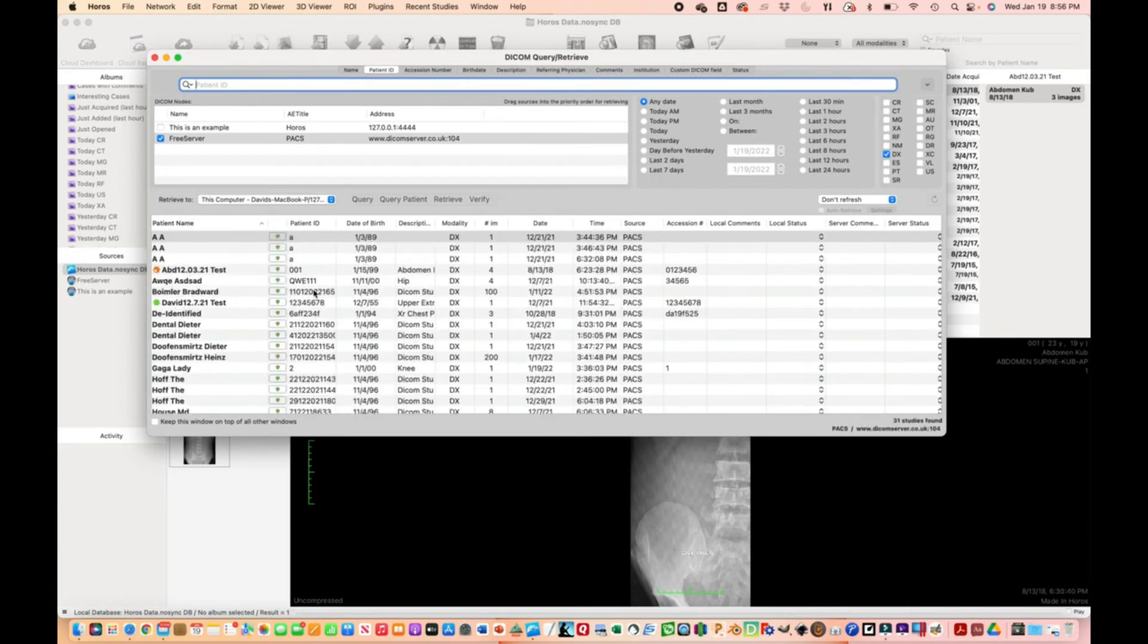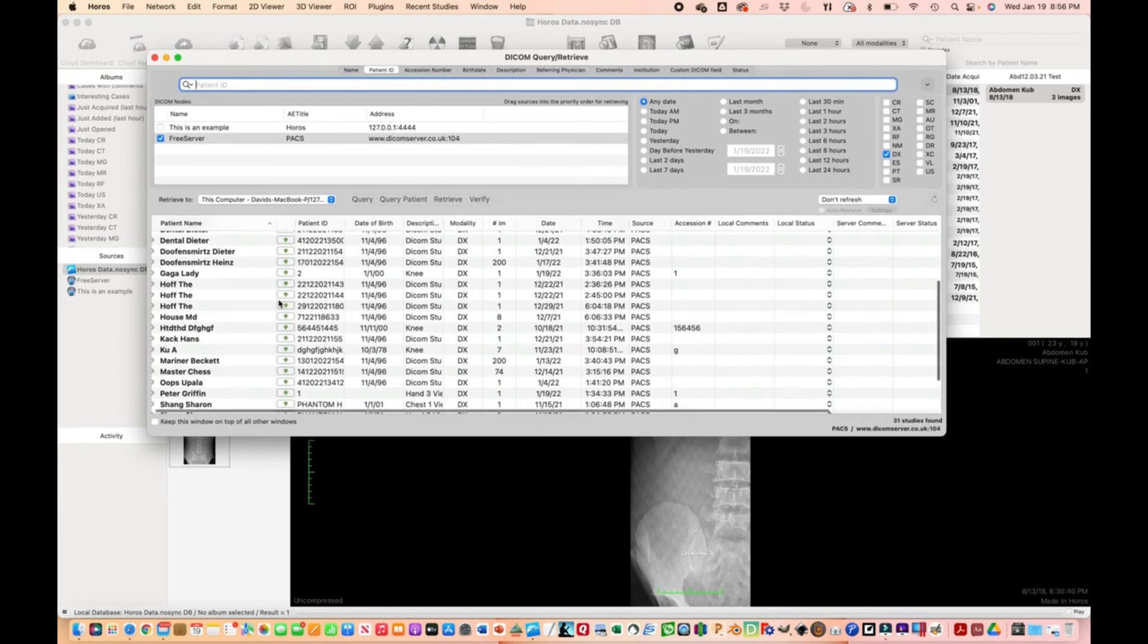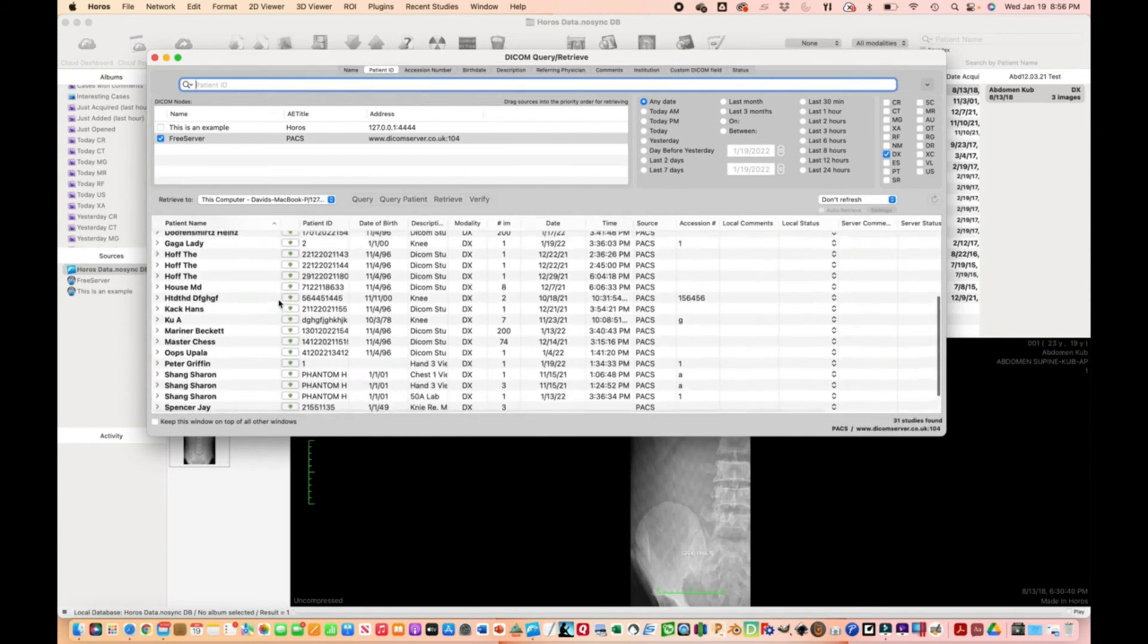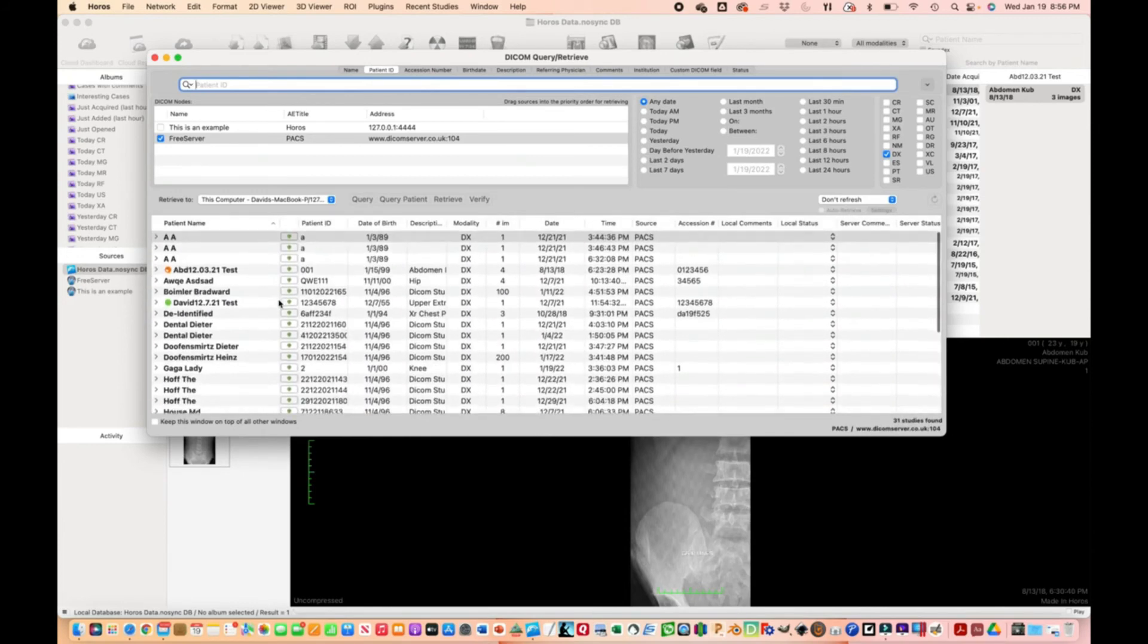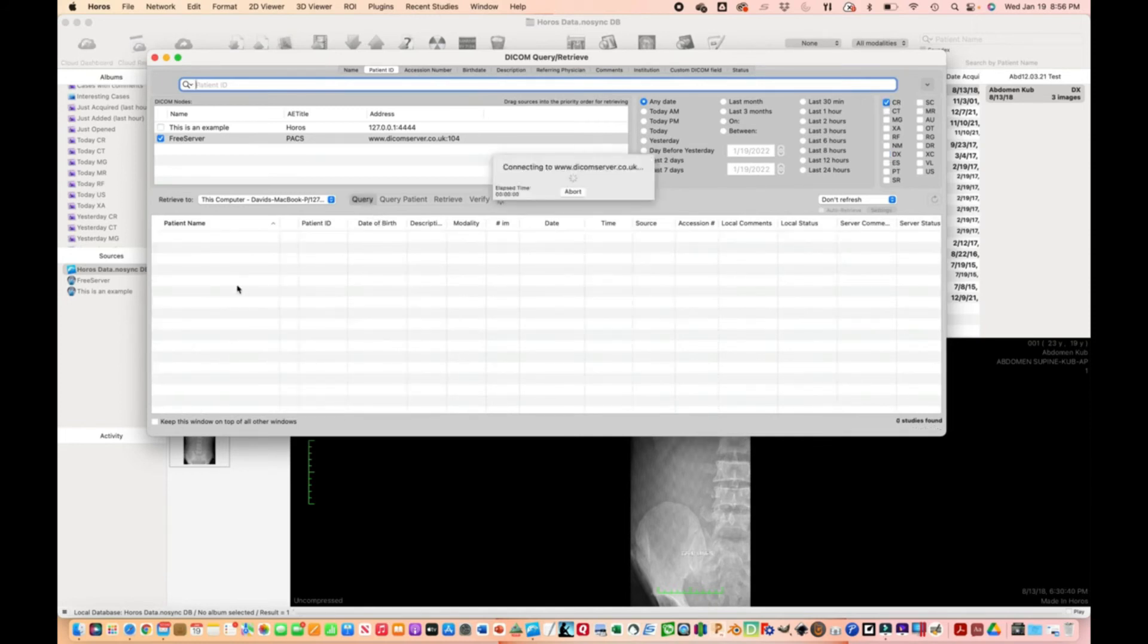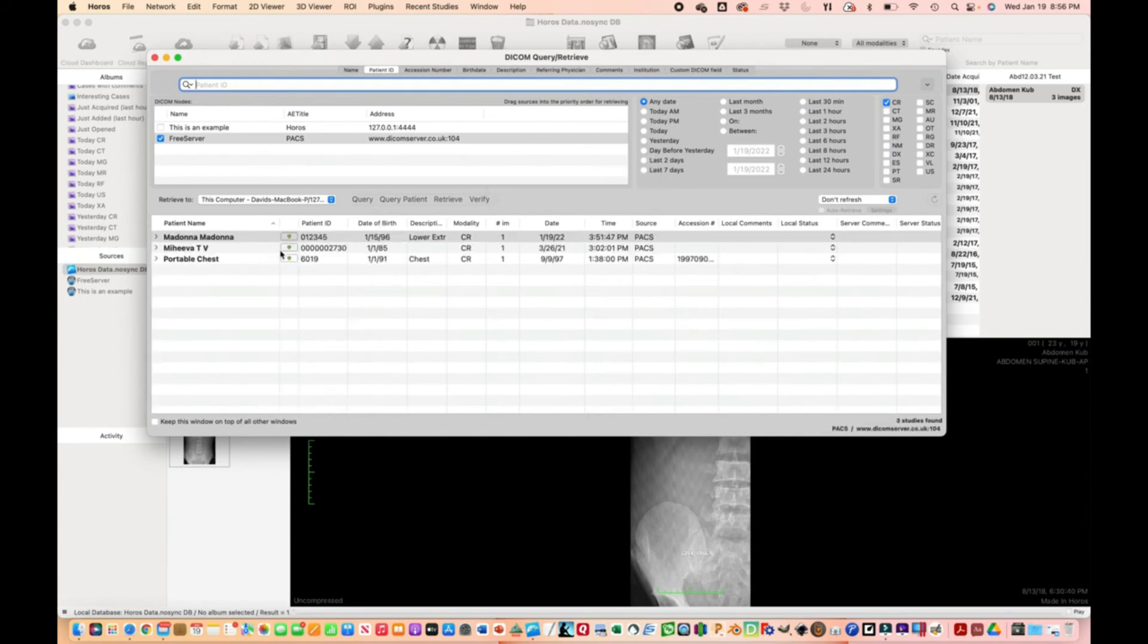That will find all the digital images on this PACS server. If you select CR and deselect digital, it will find all the CR images.